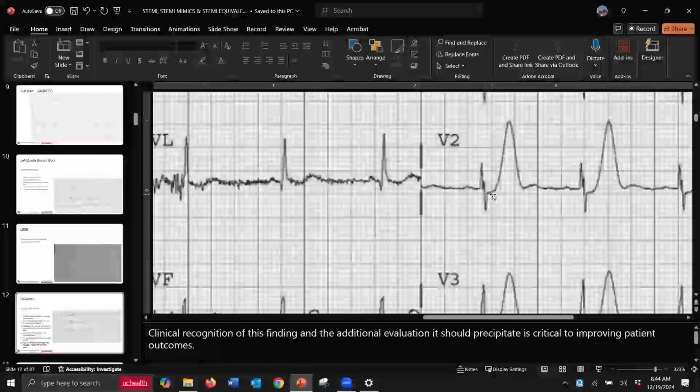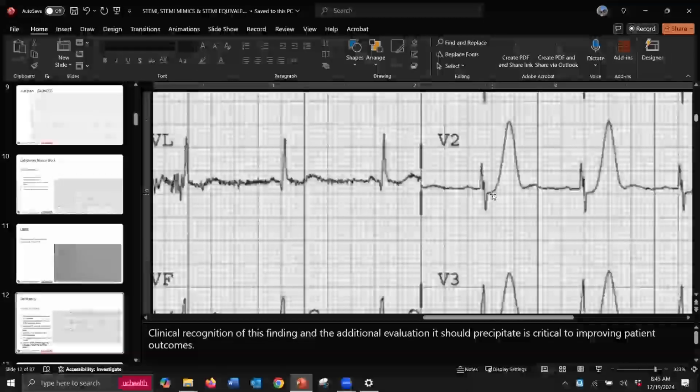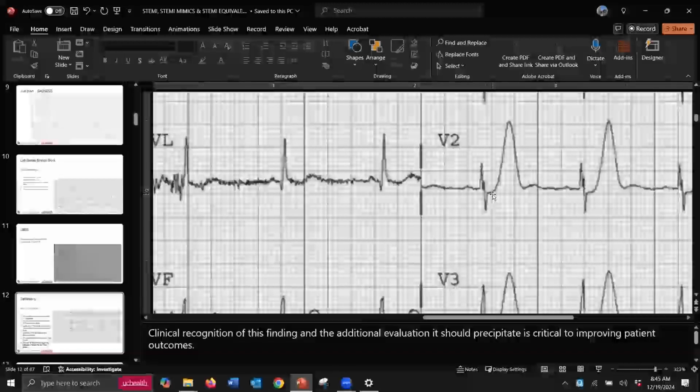What is the normal duration of a T wave? That does mean something now. It got us through the test at one point in time, but it didn't mean anything in the field until now. Three small boxes, 0.12? Or 0.16 to 0.20. Okay, so I was in the middle. You were in the middle.